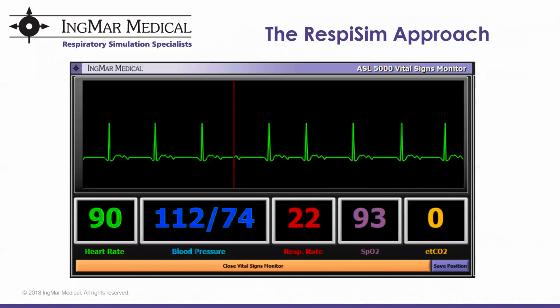So in our primary configuration, that USB monitor is connected using a USB cable to the main computer that's used by the instructor. But that being said, you can really use any sort of external display that you want. It's basically just an external monitor for dragging over a window and having it appear there.